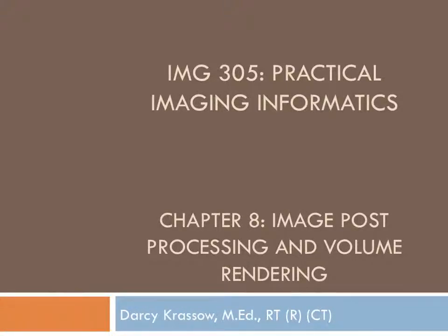Chapter 8, Image Post-Processing and Volume Rendering. Nearly all images produced in a radiology department are processed to at least some extent. Some processing is utilized to bring out certain features like bone and soft tissue kernels in CT, or to provide a higher resolution like in MRA.